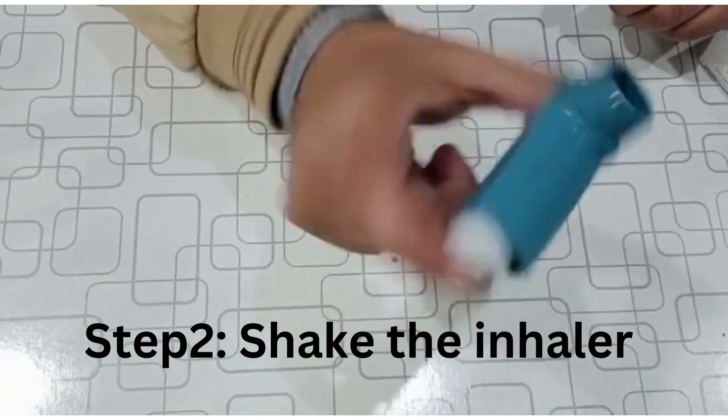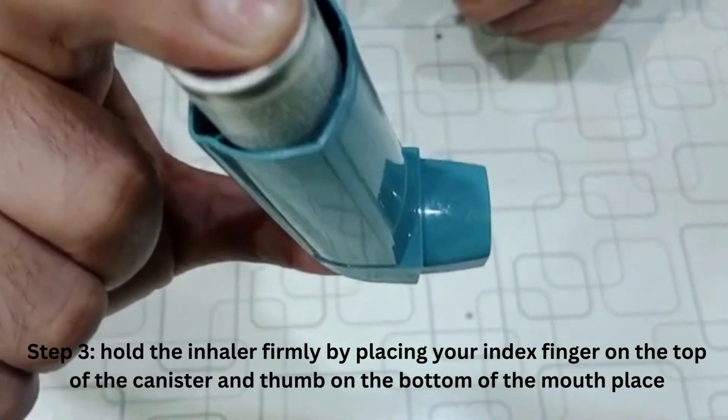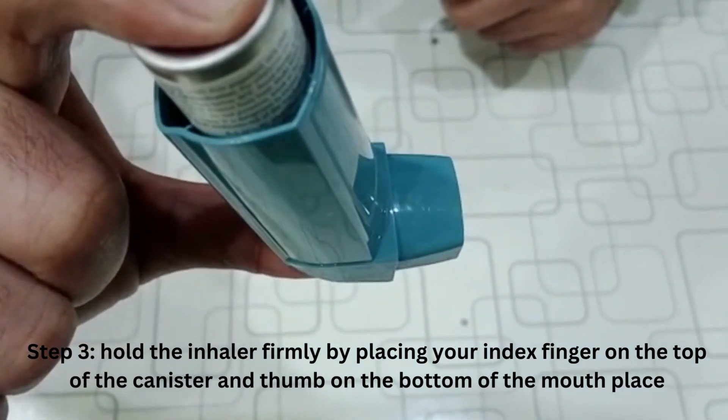In step 3, hold the inhaler firmly by placing your index finger on the top of the canister and your thumb on the bottom of the mouthpiece, and press the inhaler.